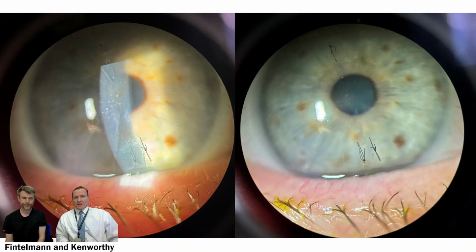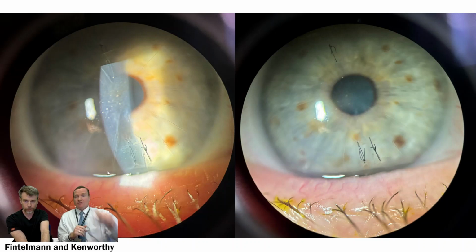Well, I think it's amazing. Here's the one-day post-op appearance of what those stitches look like in the cornea, one superior and two inferior, to try to close up those gaping wounds. And again, here the straight part is in front, and this little knot is behind, so it's further in, deeper into the cornea, and I try to make sure that these ends at least are pointing in one direction, which would make removal a bit easier.